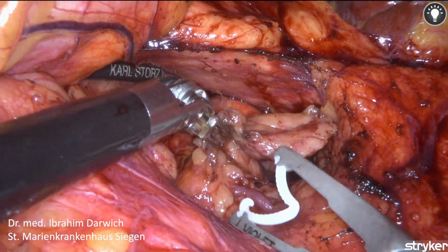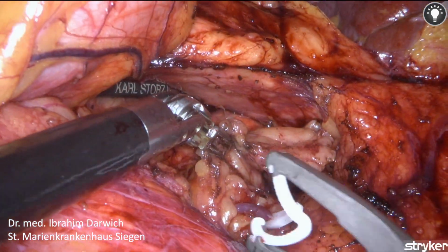The first vein collateral in the perirenal fatty tissue is clipped and divided.